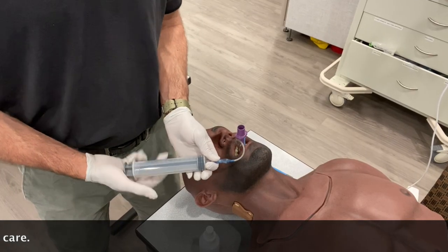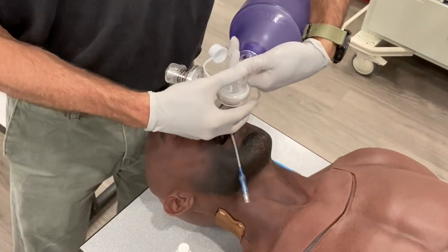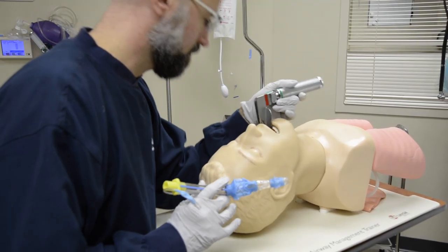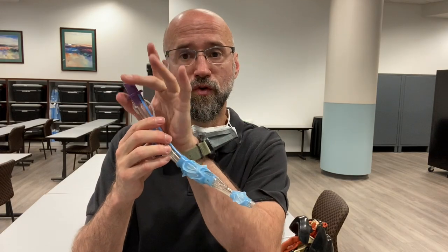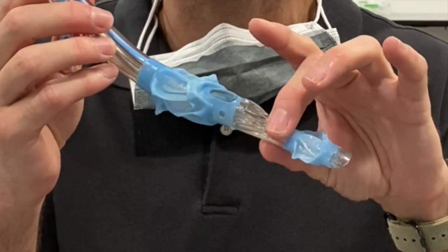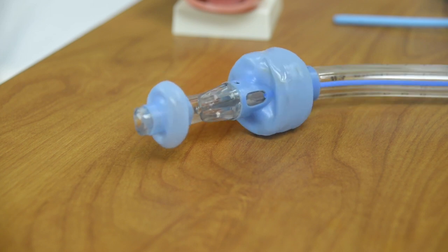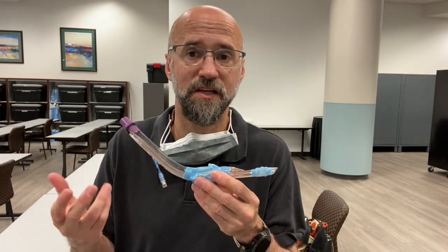The King Airway is an excellent rescue or alternative airway device if endotracheal intubation cannot be accomplished quickly and easily. The tube is placed into the esophagus either with a laryngoscope or without, and air passes through the normal port from the BVM through the side ports from the esophagus into the trachea, with a distal balloon and a proximal balloon obstructing air from coming out. Eventually this will need to be changed — in the ICU the patient will need bronchoscopy or other procedures, and an endotracheal tube, although not emergent, is a better option.